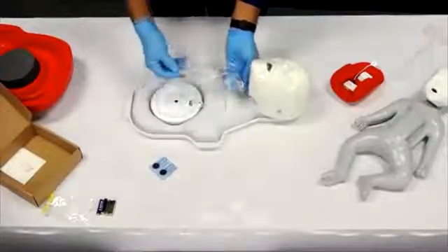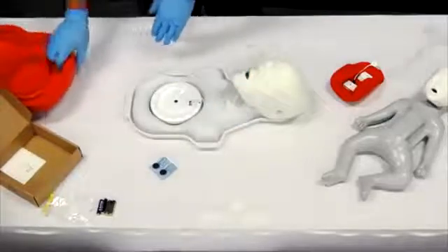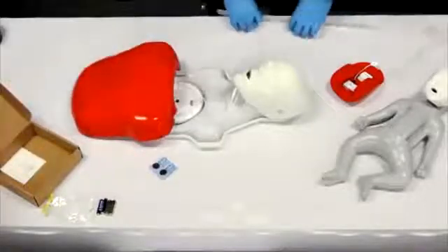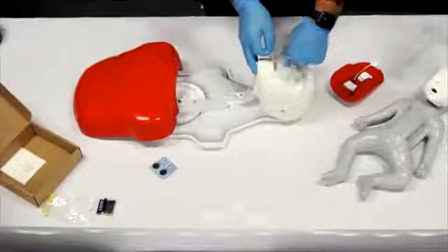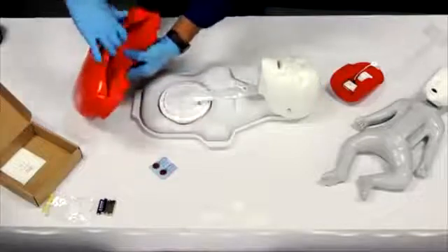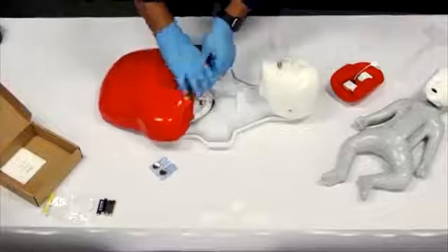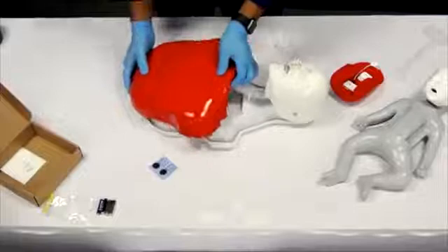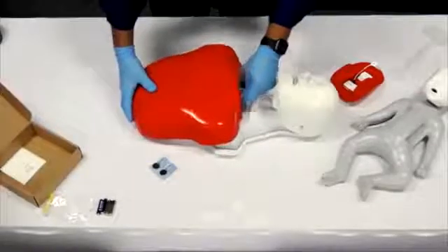As we have already just done that at the previous presentation, you would just simply follow the same steps outlined there. And then you would just fit the chest over the white base once you're done. And you do have to slide the bag into the little chest slot that Colette is showing you. And that's where the bag should rest.